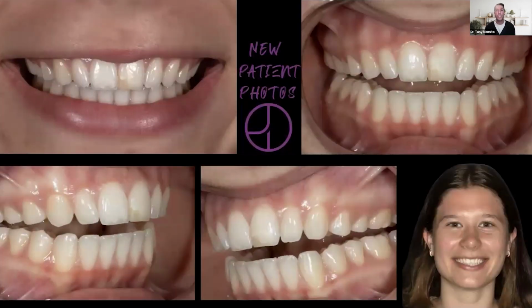We have basically two sets of photos that we take. We have new patient photos, and then we offer a cosmetic consult as well, where patients will come in for a specific problem. Maybe they're interested, like this young lady, who has a class 4 that she's not happy with. So it's a really simple photo workflow. Our team is responsible for creating these, and they are very good at their job. We've trained them to be very good at their job. It's hard for me to diagnose and teach if I don't have good photos that I can show the patient.